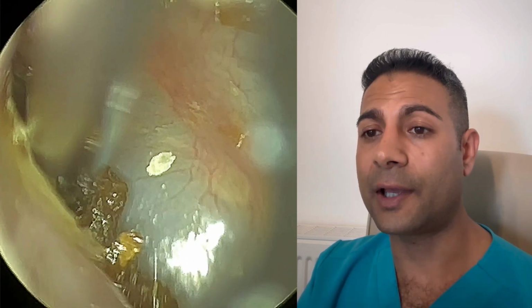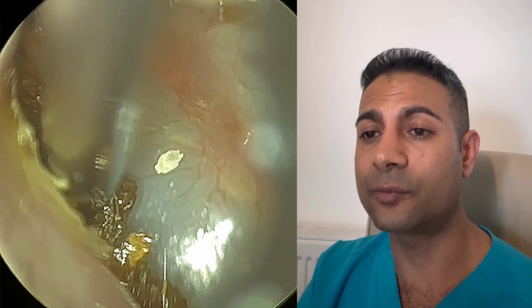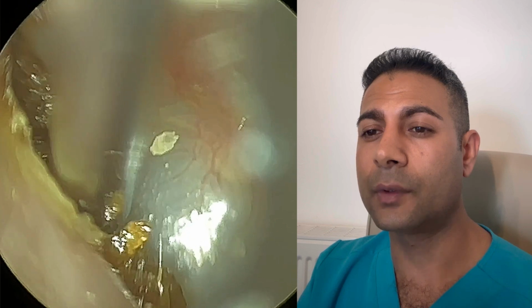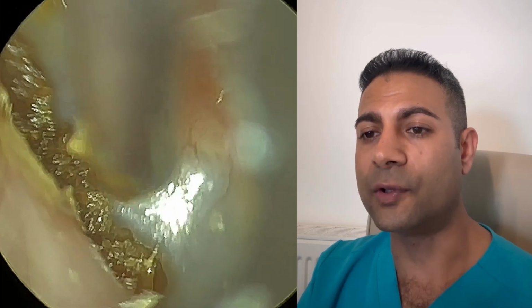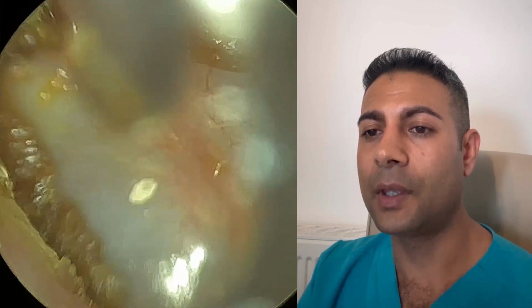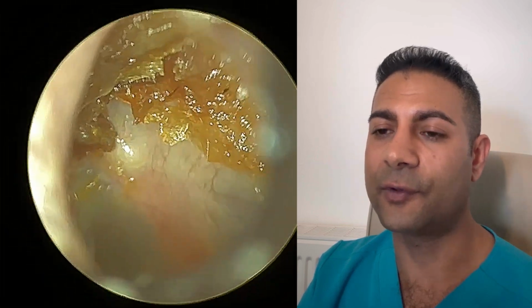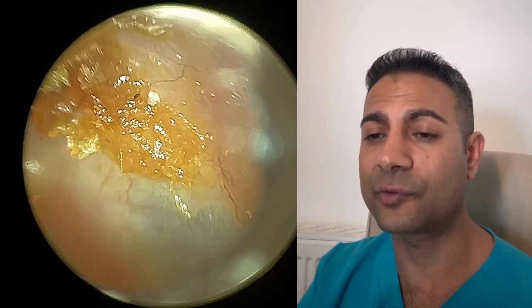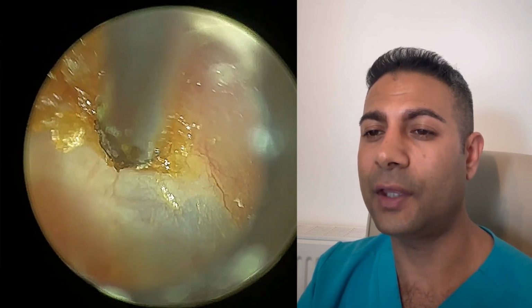Now this patient has to attend biannually, so they are a frequent flyer, so to speak. They do produce a lot of dead skin, so not only is this earwax, but it's a higher concentration of dead skin. And because they have quite a prominent anterior recess, it's likely that the skin, as it's migrating off the eardrum in that region, is getting trapped in that pocket, leading to an overall impaction of the ear.